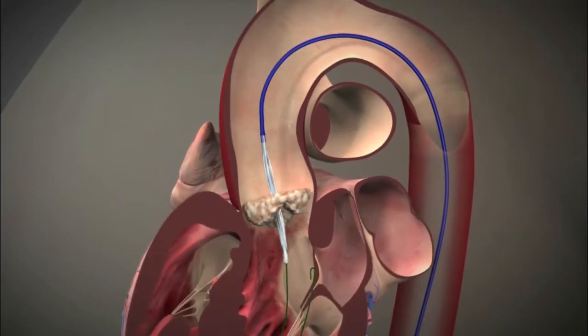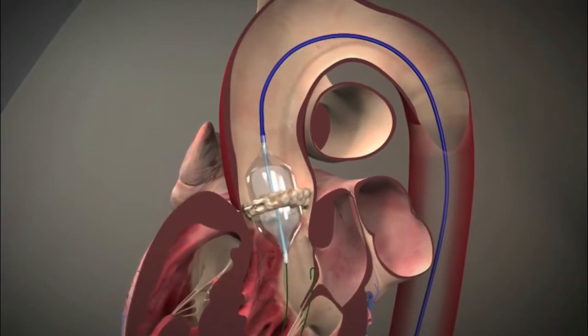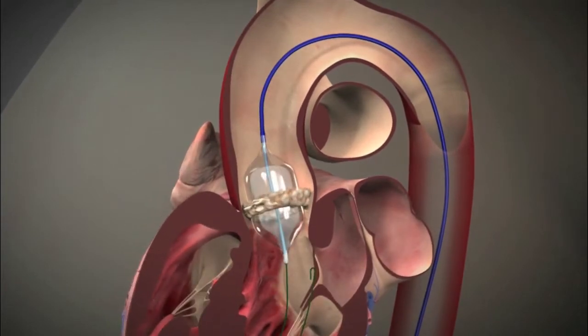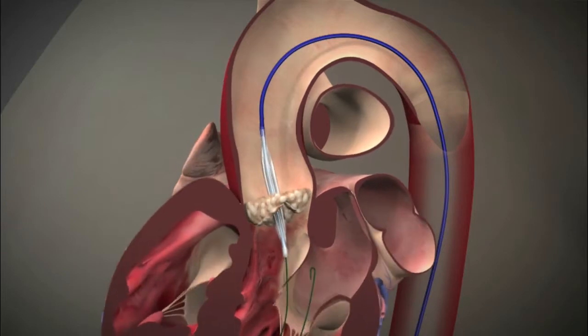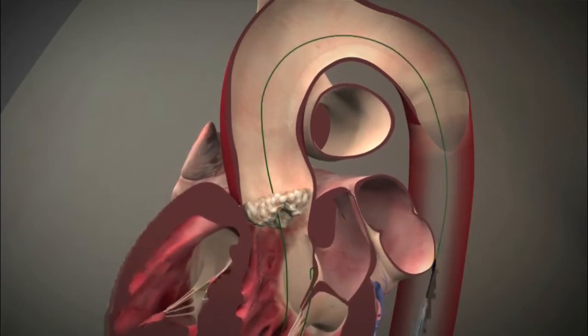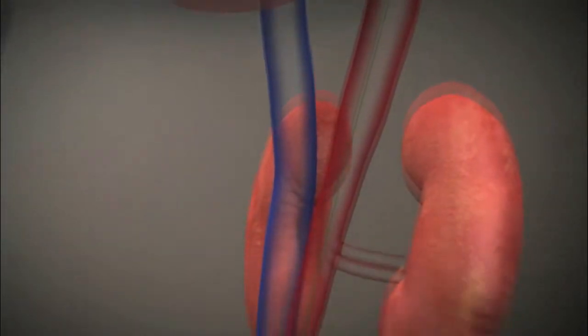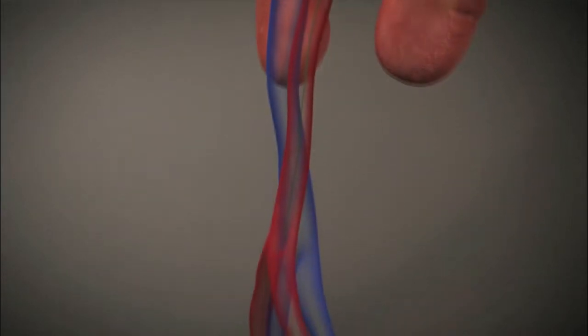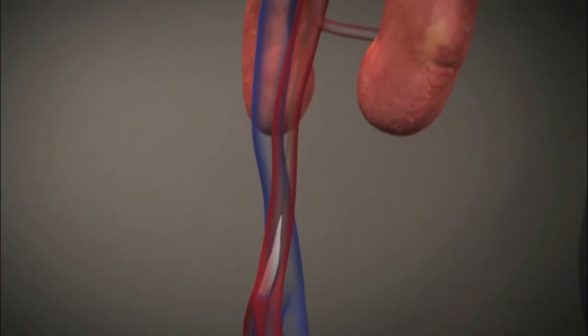The balloon is inflated, opening up the stenotic valve, breaking up the calcification and freeing the leaflets. All of this is in preparation for the transcatheter valve to be inserted.